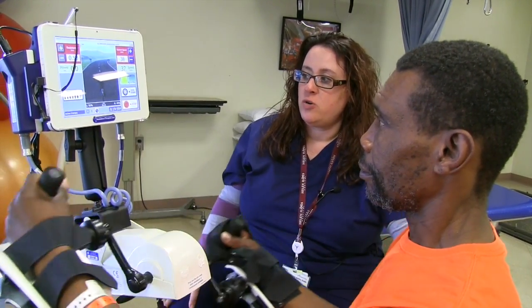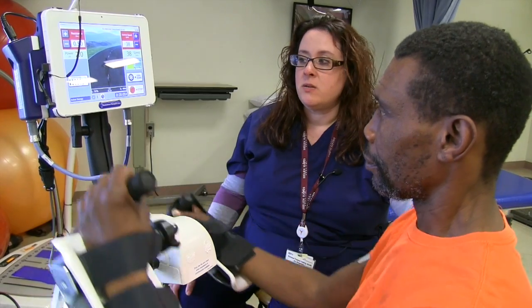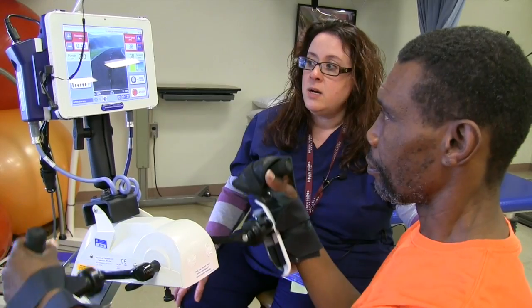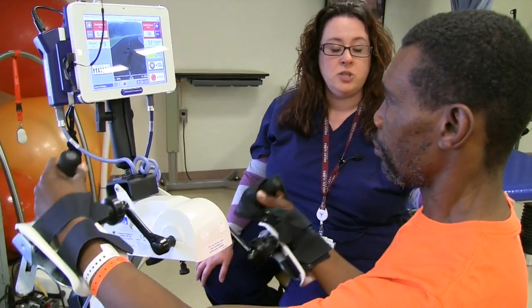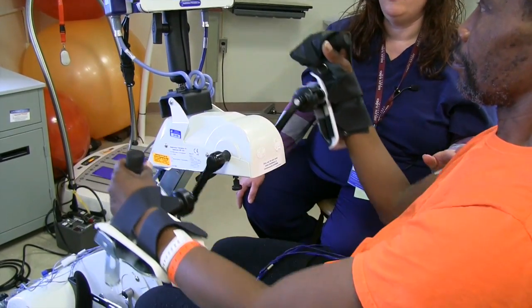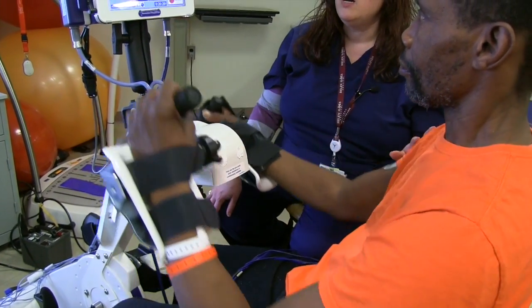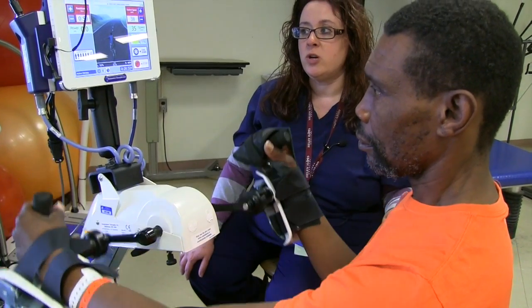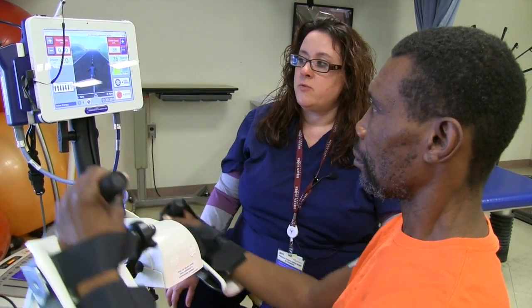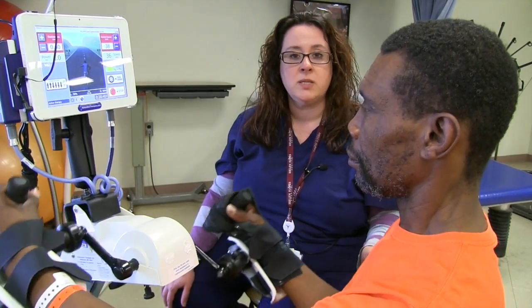I'm currently using it with Joe for his right arm. Basically, it targets certain muscles in his arm that we want to promote and improve movement and function. So right now I have it on his shoulder and onto the muscles in his arm — one muscle helps him reach forward, and the other muscle helps him straighten out his elbow. Those are two movements that Joe has some weaknesses in, so we're trying to target those. Later on, as we progress, we will target other muscle groups. This is his first day, so we figured we'd start with his shoulders to stabilize his shoulder and shoulder blade and two of the muscles in his arm.